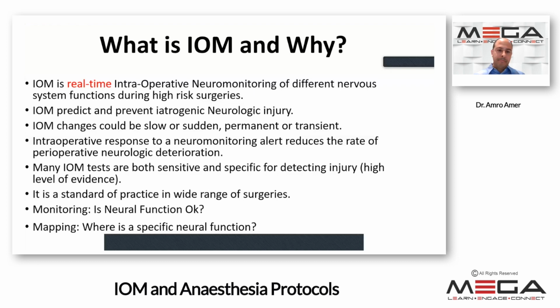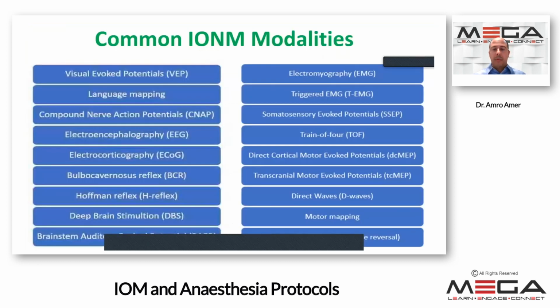We have a lot of tests actually. Mainly, as you see in the list here, those are the main and commonly used modalities we use in the OR. EMG, triggered EMG, sensory, that's for sensory function. Train of four, you all know about it.